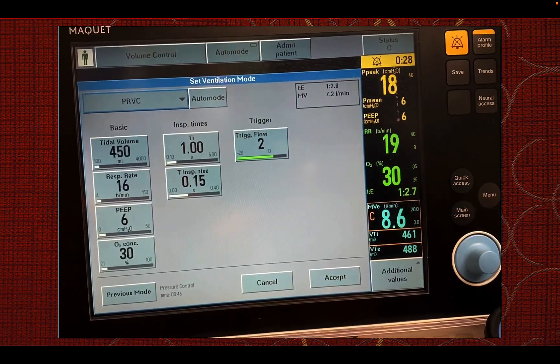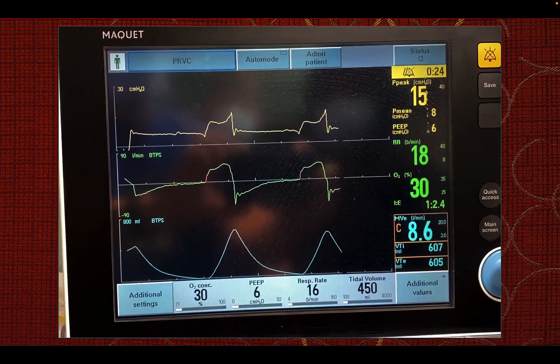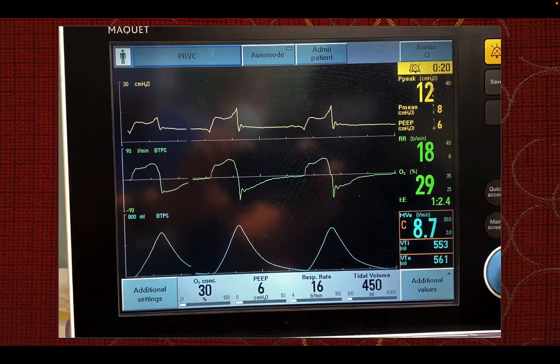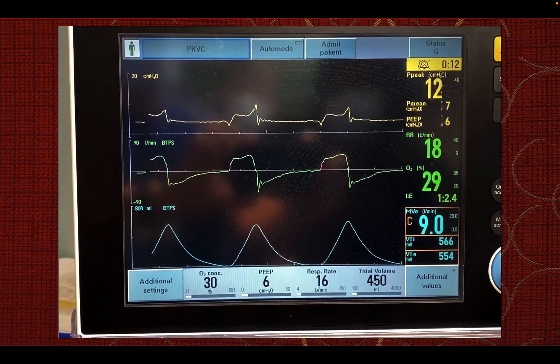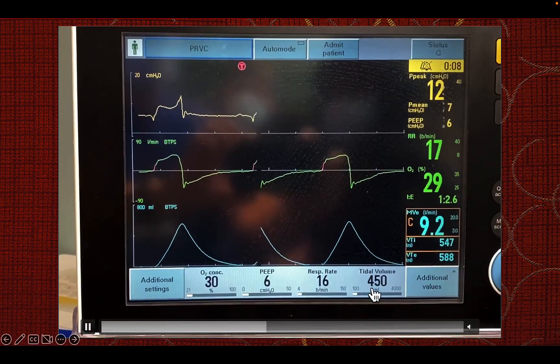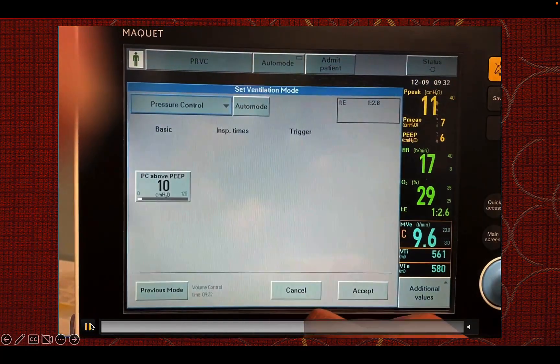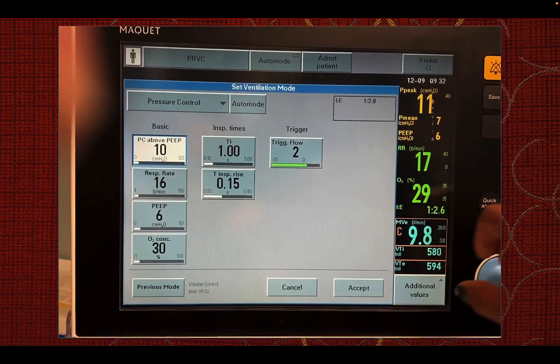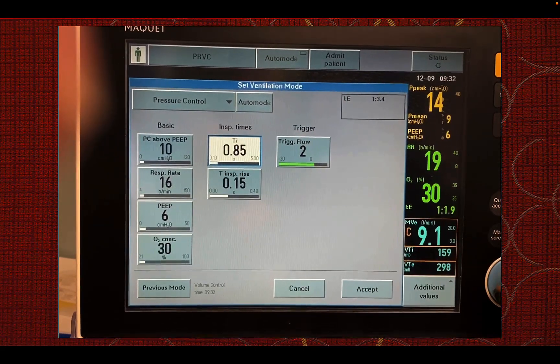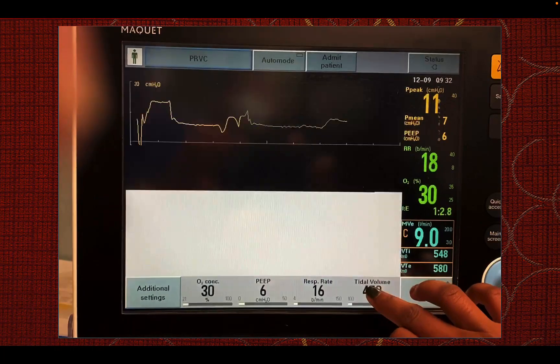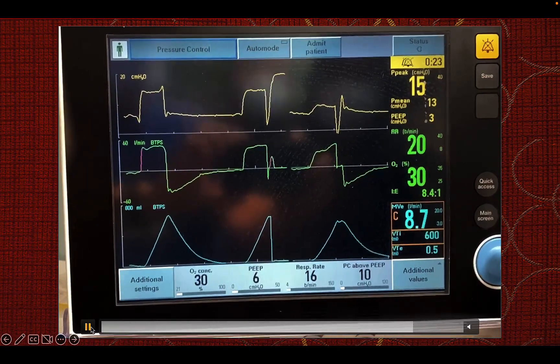My hospital tends to love PRVC — pressure-regulated volume control. We're going to hold here for a minute. PRVC is smart pressure control, so I want you to watch if it's really being smart and adjusting to the patient's tidal volume, or if something isn't working right. You can compare your set tidal volume goal to what the patient's actually getting. We notice some changes, so I change the mode again to a pressure control mode of ventilation and adjust some settings — shortening the I time and the rise time a little bit.